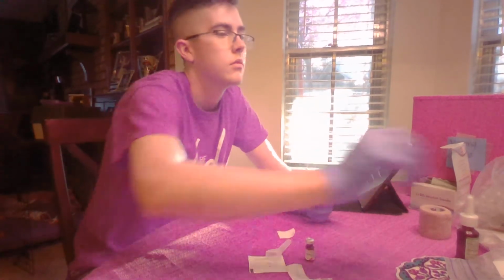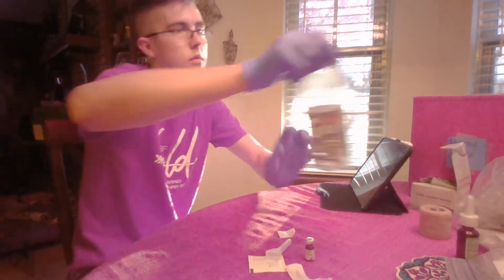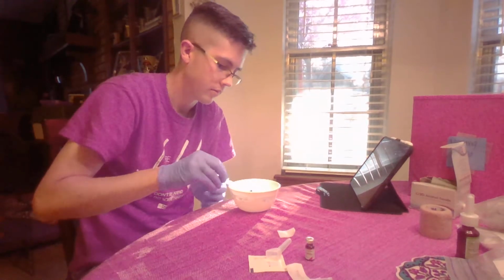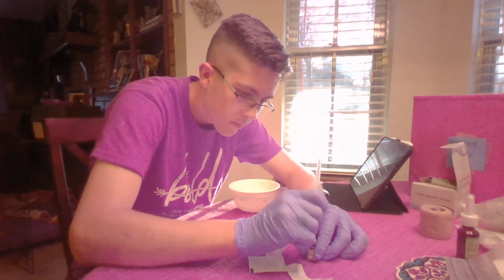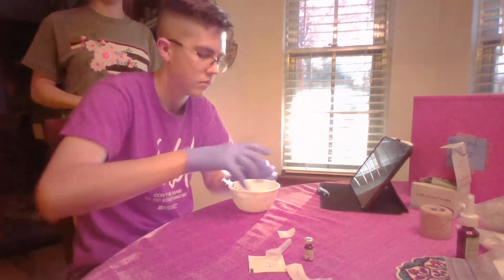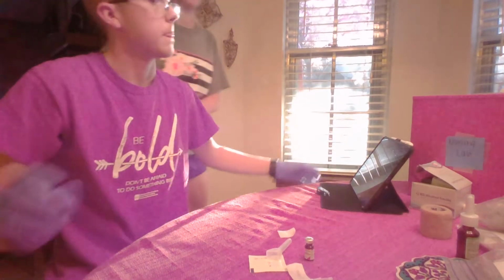I mean, if you so wish. Okay, gotta refill up my vial. Can you scoot in the shoe? I don't know why. Can you scoot in there? Okie dokie.